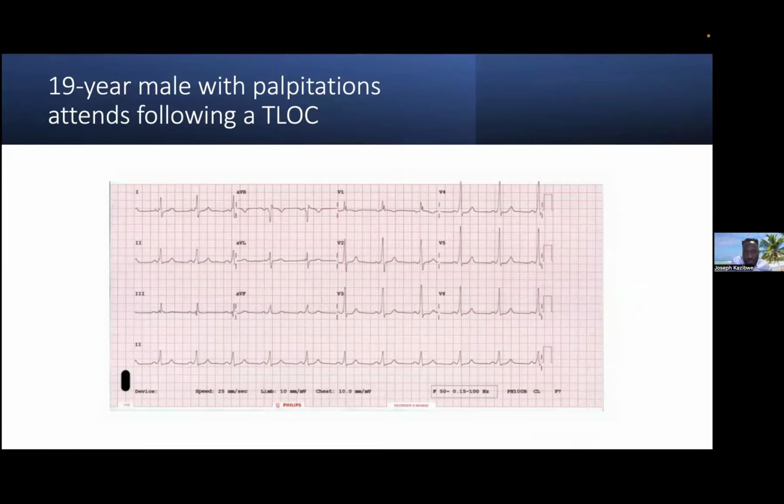So we have another couple of minutes remaining, about 10 minutes or so. A 19-year-old male attends A&E following a transient loss of consciousness. You have a look at the ECG. I will not take a lot of time.